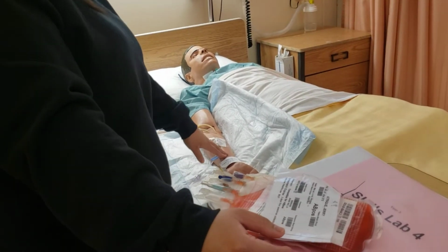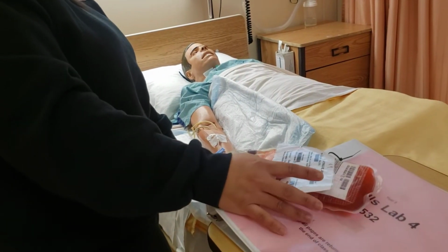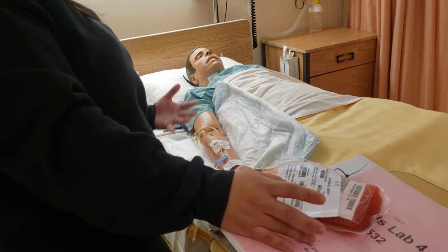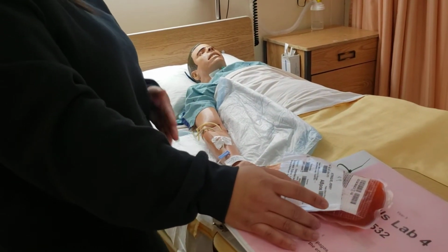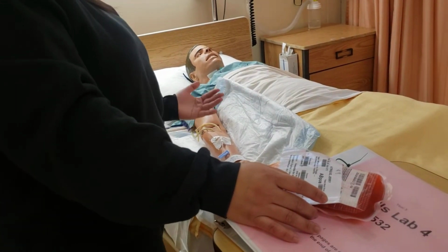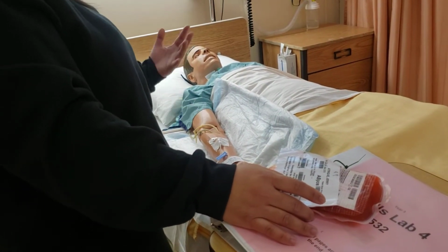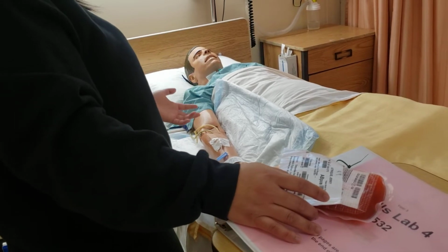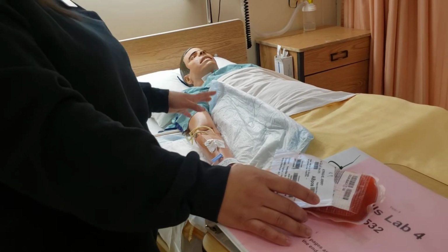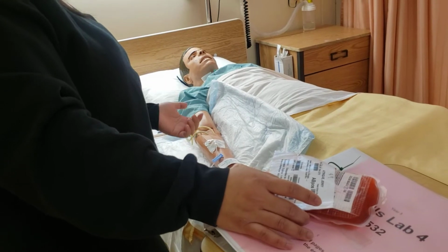So I just want to let you know that during the transfusion, I will be checking your vital signs frequently. Before I start the transfusion, I'll check your vital signs, 15 minutes after the infusion has started, and every hour during the transfusion. The transfusion is going to be 2 hours, and then I'm going to check again at the end of the transfusion, and then an hour after the transfusion has finished.